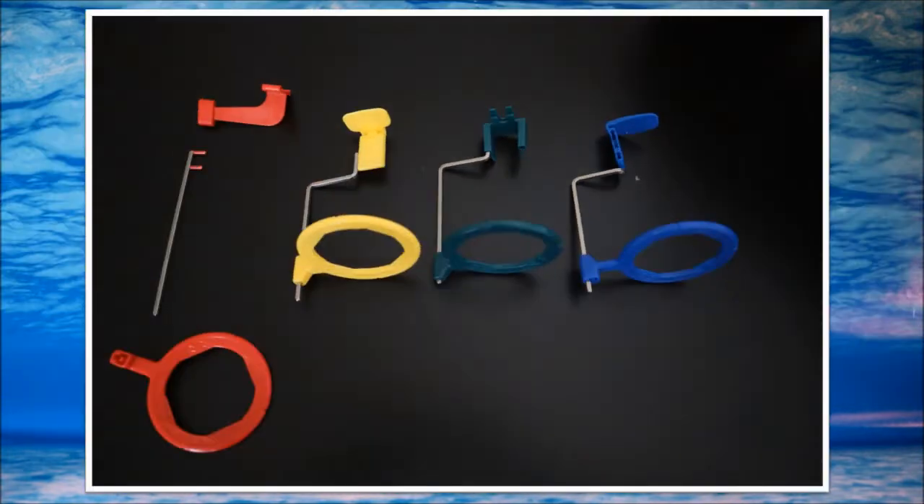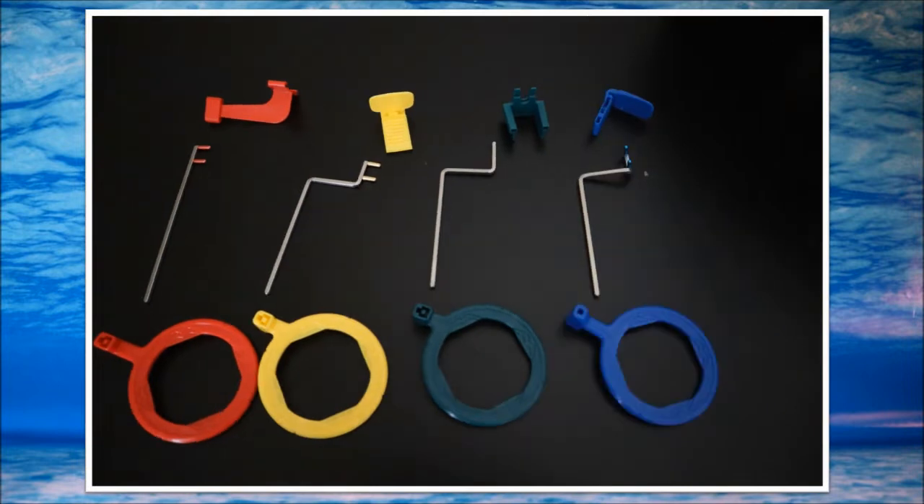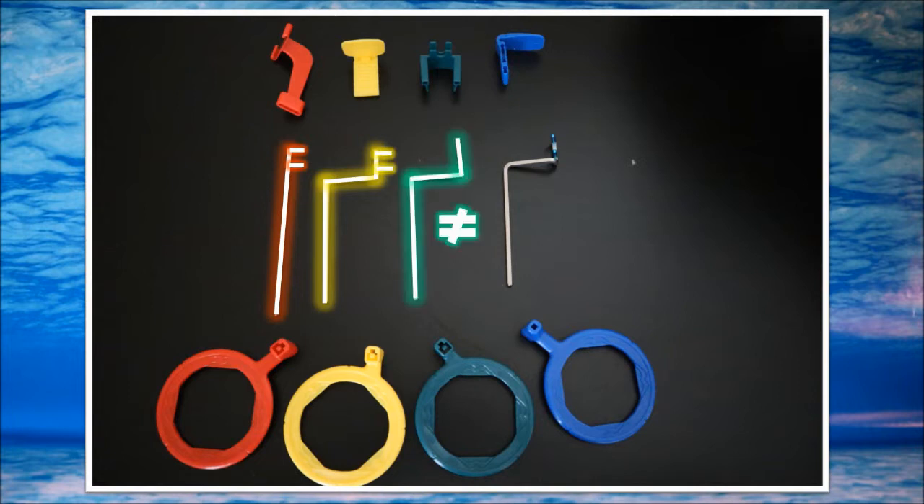First we're going to look at the black bar. Sometimes the colour on the prongs fades away, so we'll see what to do about that. For the red bar, it's going to be a straight bar with prongs. The yellow bar is going to have a tetris shape with prongs on it. The green one is going to have a tetris shape with no prongs, and the blue one is going to have prongs and a tetris shape.